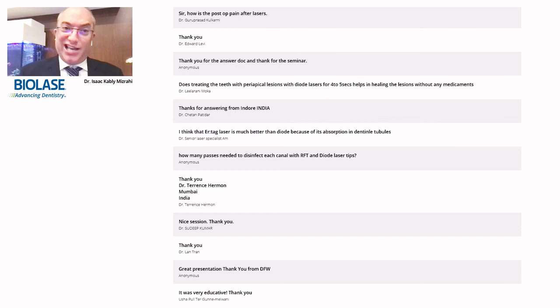Okay, eye protection, that's a huge thing. You cannot use a laser if you don't match your eye protection and your eye coverage with the wavelength you're using. It's highly important. It's mandatory to use eye protection that matches the wavelength that you use, with your protective glasses. That's mandatory. I recommend never ever using a laser without eye protection that matches the wavelength you're working with.